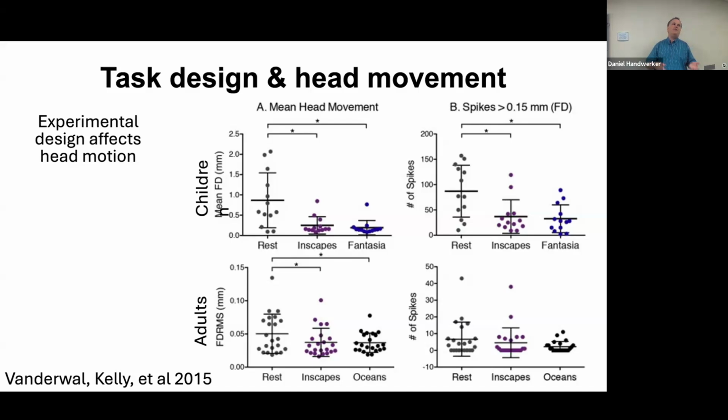So this is an example when thinking about noise. We can talk a lot about noise and how to correct for it after the fact. We can also talk about how to reduce noise while we're collecting our data. So I just wanted to throw this in as one example.